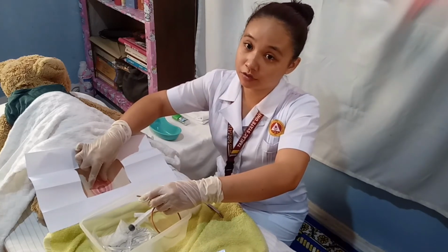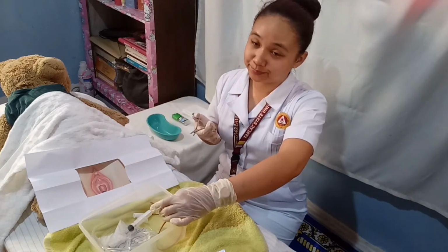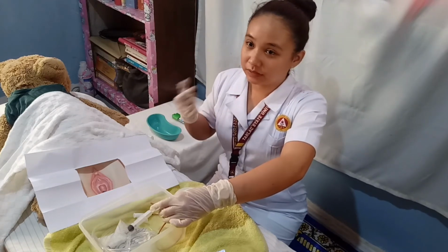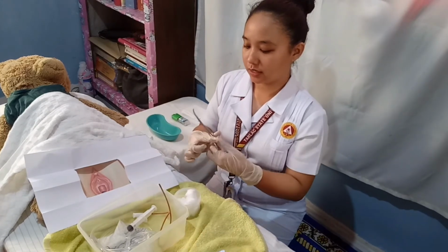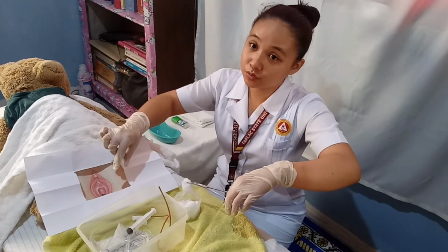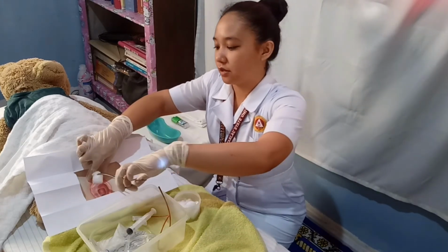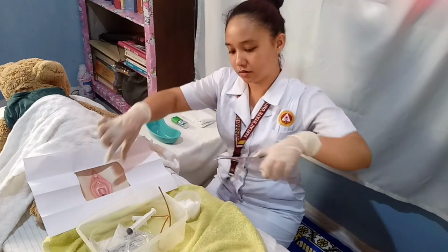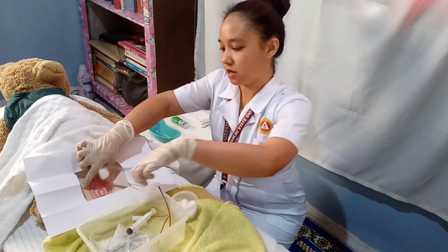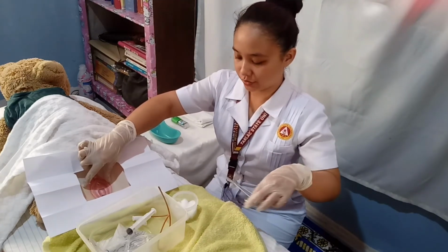Then, using cotton balls with forceps, you need to clean both labial folds and directly. Then you need to move the cotton ball above the meatus down toward the rectum, and then discard. One, discard, two, discard, three, discard. So there you go.